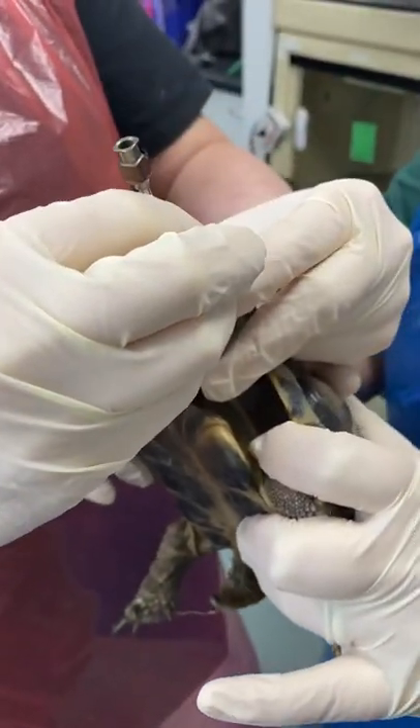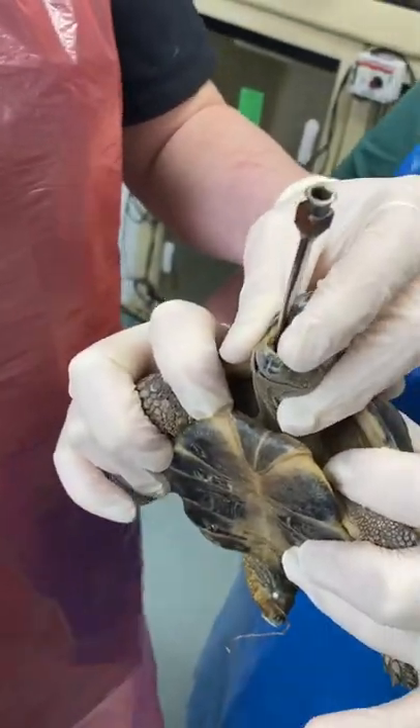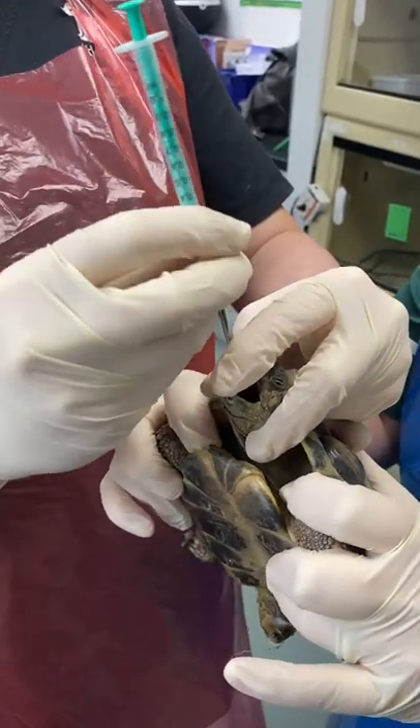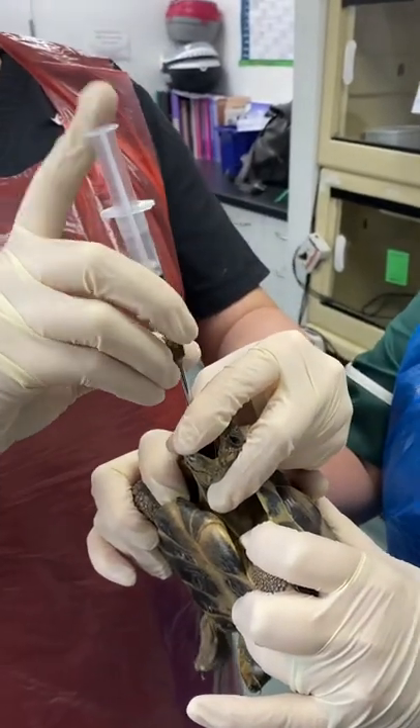You just pop the tube down to your pre-measured point. We then have our medications drawn up ahead of time and inject that wormer in. Obviously when we're worming tortoises, we should only ever do it based on a positive worm egg count.